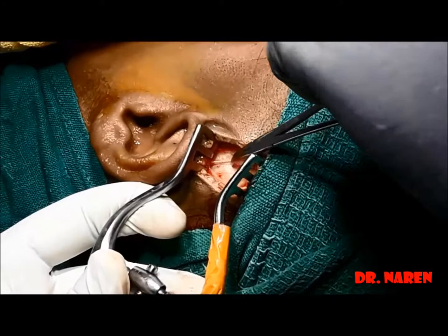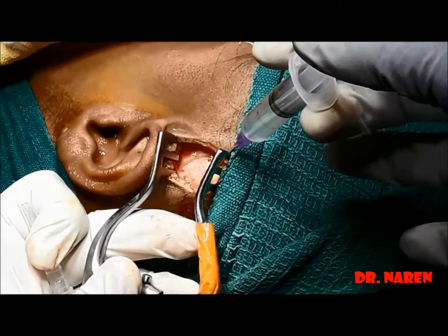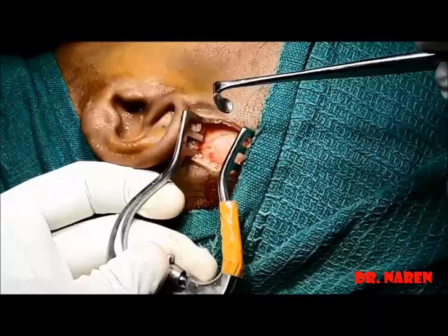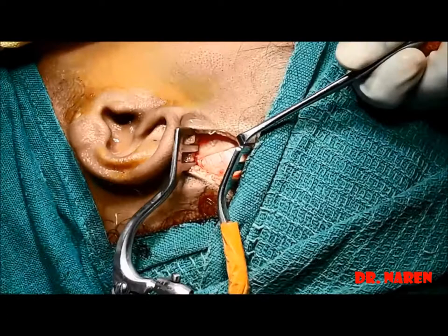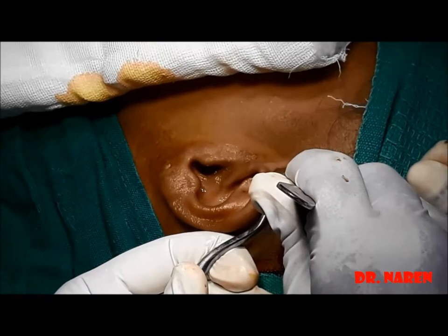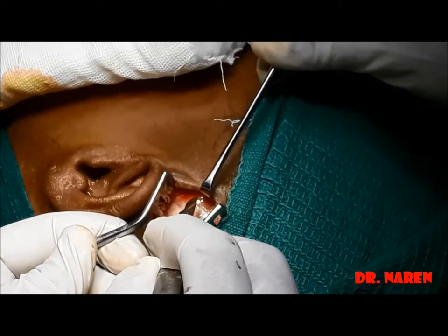After reaching the deep layer of the temporal fascia, normal saline is injected between the deep layer of the temporal fascia and the muscle for hydrodissection, to separate it from the muscle and make removal of the temporal fascia a little easier. The needed amount of incision is then made over the deep layer of the temporal fascia.